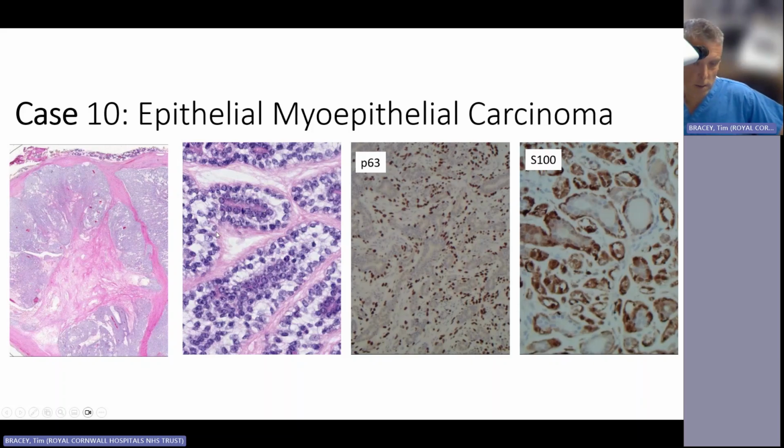The nuclei are different to adenoid cystic, so you get nice round, more epithelioid, classic epithelioid myoepithelial cells, whereas in your adenoid cystic, they tend to be sort of triangular and hyperchromatic. And this is a classic appearance. They don't always look like this, unfortunately. Sometimes you can have them with quite pink cytoplasm.